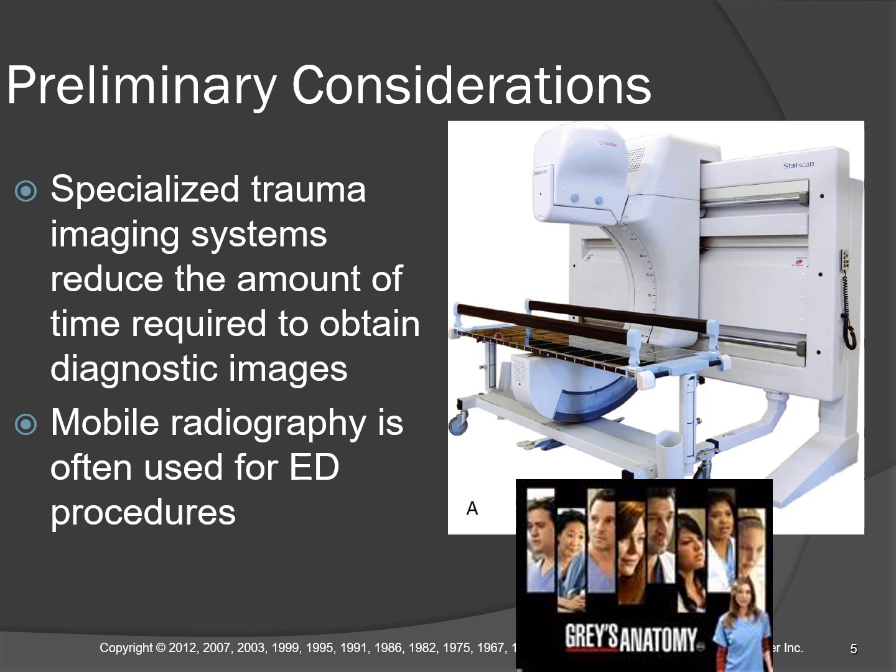It's fantastic for that one x-ray of a severely injured individual where the trauma is so severe that it's whole body trauma. It's not just an ankle, but possibly multiple areas of life-threatening trauma, and you need x-ray on your way to surgery. Yes, this machine is fantastic. However, it is a unitasker that probably starts around $500,000.